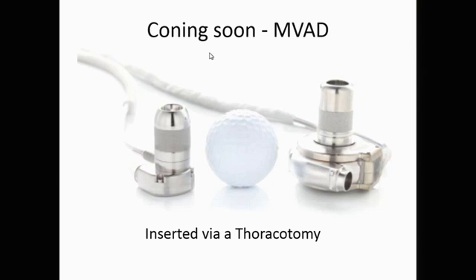And that will be a game changer because instead of having major cardiac surgery, this will be something that you could do in anybody. The other thing that will do, probably, is make it so that our threshold for inserting these devices is going to be significantly lower. So this device, if it actually pans out, and we don't know if it will or not, if this actually happens, you will see this device used far more liberally than any of its alternatives.